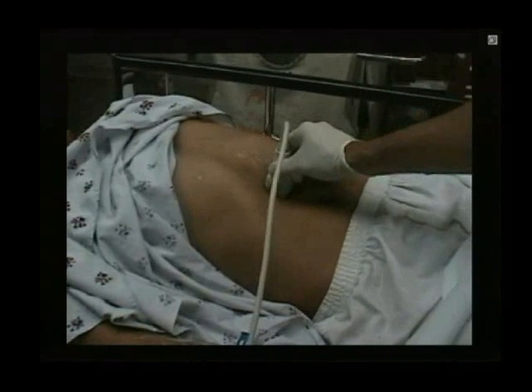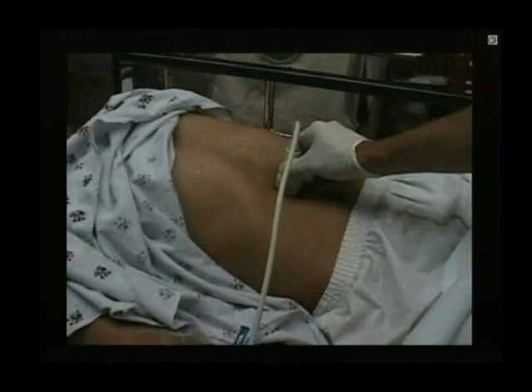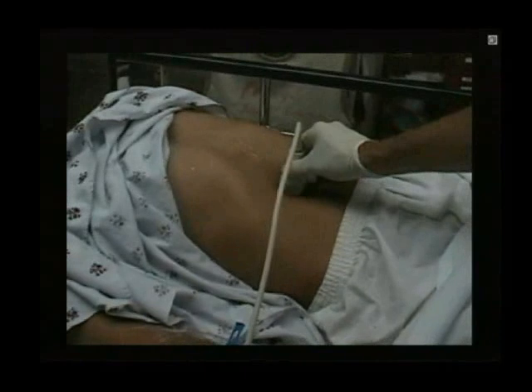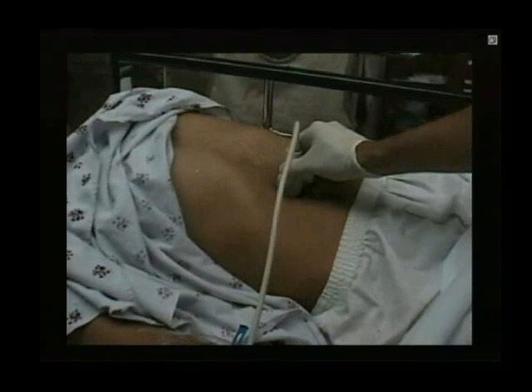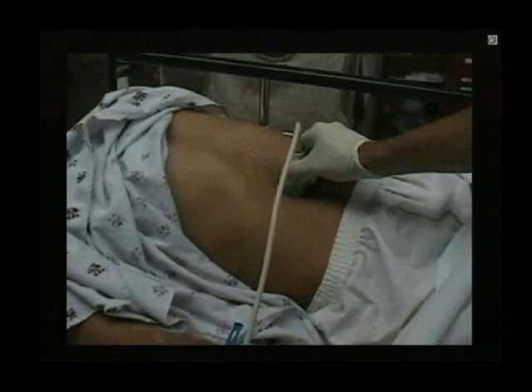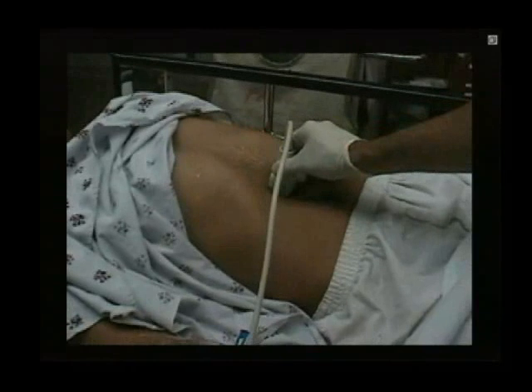Question: what's the difference between the outer diameter and the luminal diameter, is that muscle? Good question. The inner lumen is blood. The very outer diameter would be the outside wall, and the thrombus is in the middle. There may be some calcific wall within it as well. But we want to measure that whole area. That's the width of that aorta.